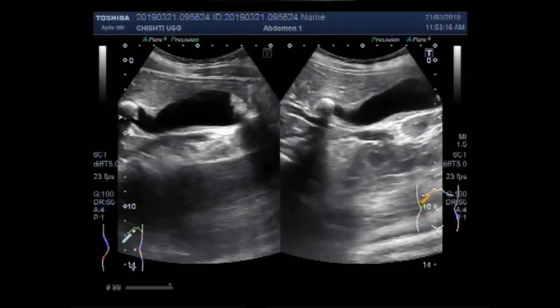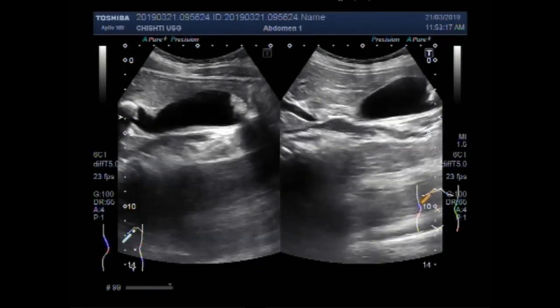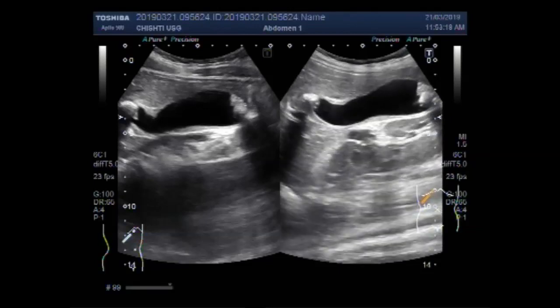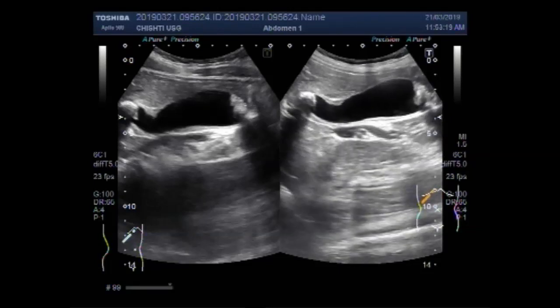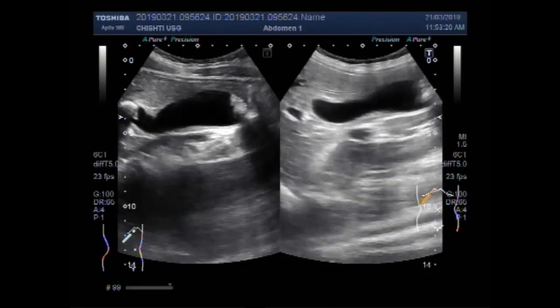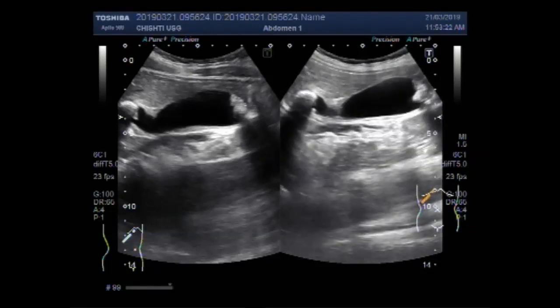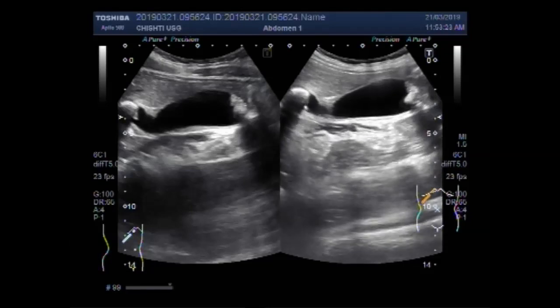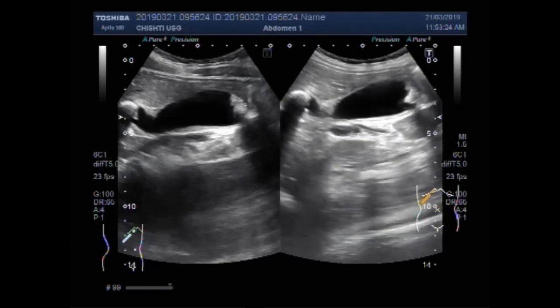Again you can see, while the patient is lying, the gallbladder is positioned sideways.